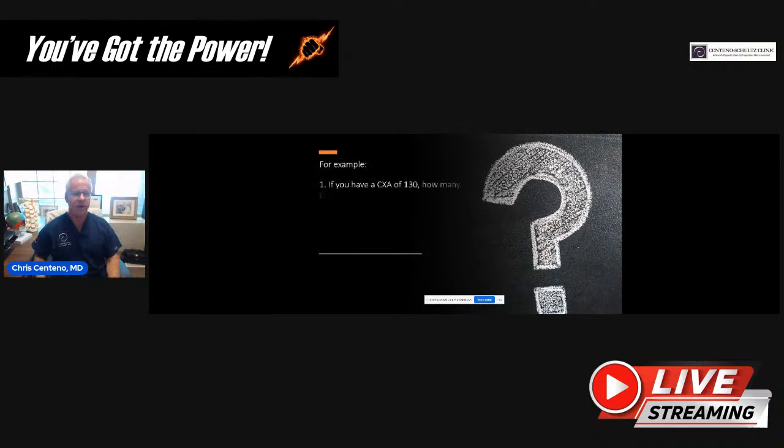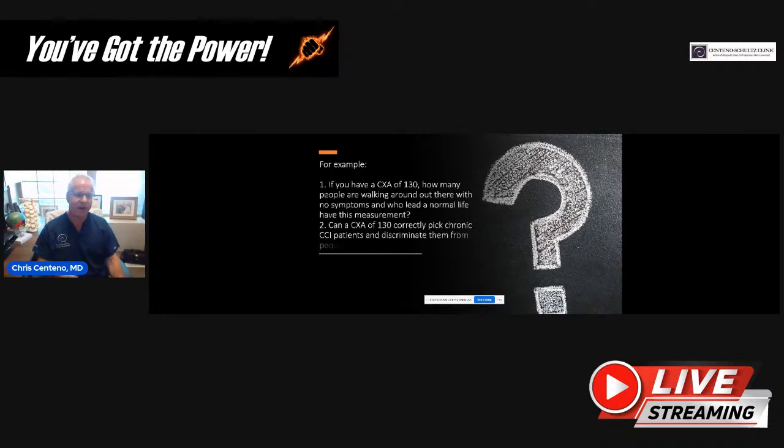Now, here's a concept. I just went online, went on Google, and typed in clivo-axial angle. A page came up with 3 different references, basically stating that a clivo-axial angle under 135 is an abnormal finding indicative of CCI, or craniocervical instability, in this case symptomatic or disabling CCI.